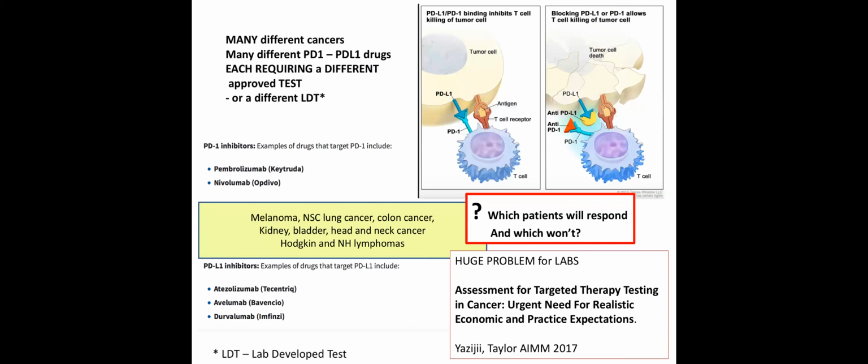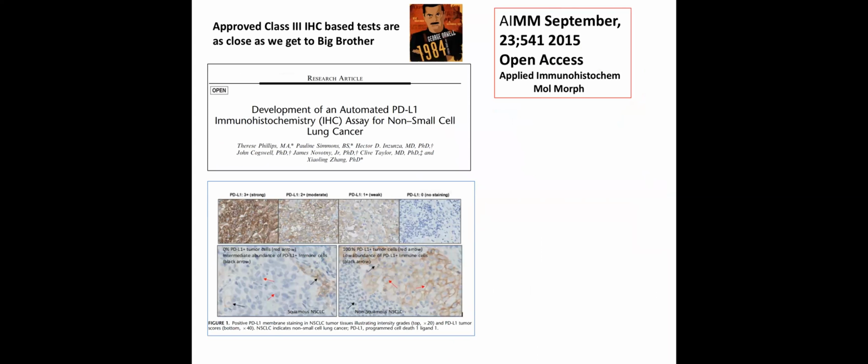So one way around that, it has evolved that labs are beginning to use lab-developed tests. This is a mechanism, of course, that has been there for years. Call them home brew, if you will. And I'll get back to home brews in a moment.